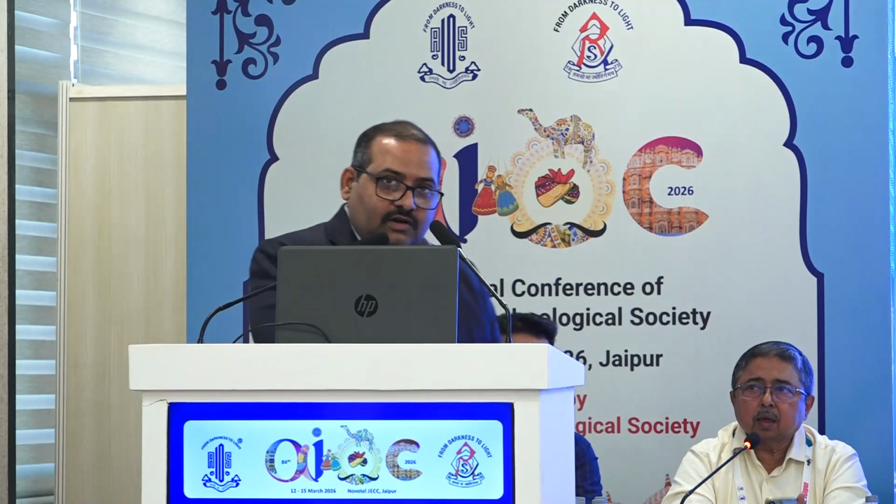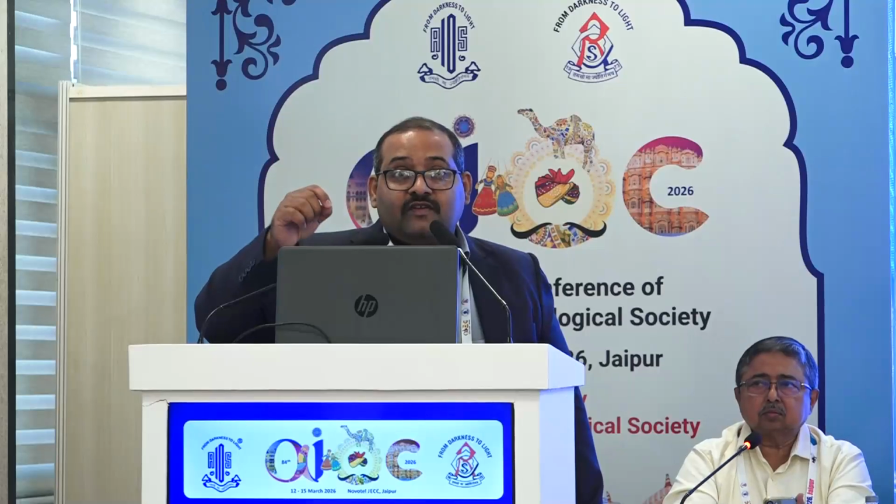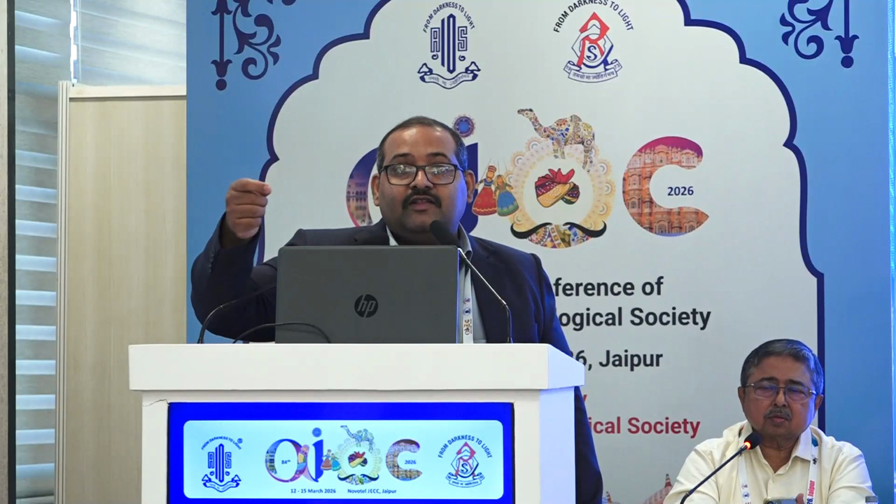See, the thing is, I just wanted to add to what Sir was saying, that please look into the technology it is based on. If it's a DL model, deep learning model, there is very little explainability and variation throws off the accuracy by a mile and more. If it is a machine learning model, it is just an advanced statistical test. So essentially IOL power calculation is a regression model that most of us have used, that it falls somewhere in that gap between two lines. The outliers are cut off, and that's the band in which the IOL power is expected to be. That's why it's called expected lens position.